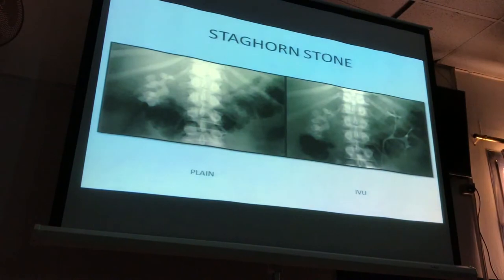Staghorn stone, in the plain X-ray and in the intravenous urography view: normal left kidney, but non-functioning right kidney. Staghorn stone. In the next exam.